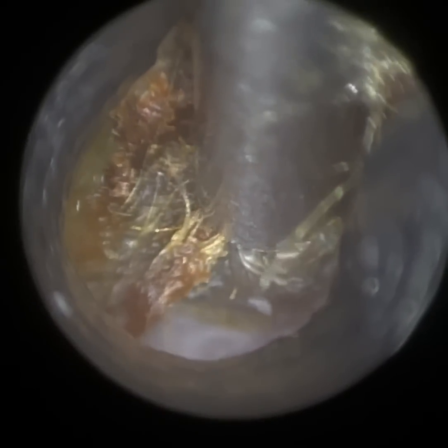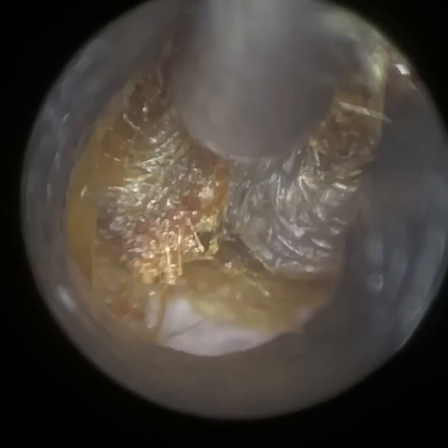You can see we've been really gentle here. I just want to go up against the canal wall and slowly then move away. So I've mobilised the bottom of this wax plug. I'm now trying to detach it from the anterior canal wall — this is the patient's left ear.